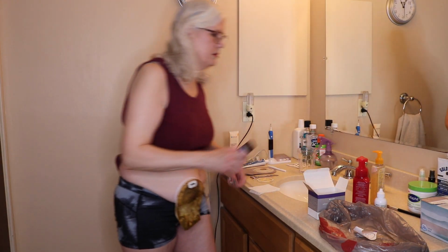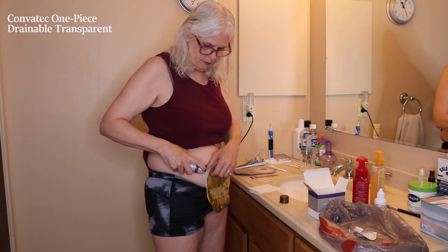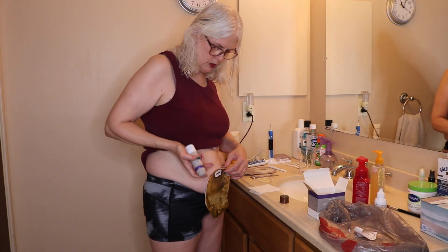This is also a Convatec type of bag. I'm forgetting what type it is. I'll leave it in the descriptions below.